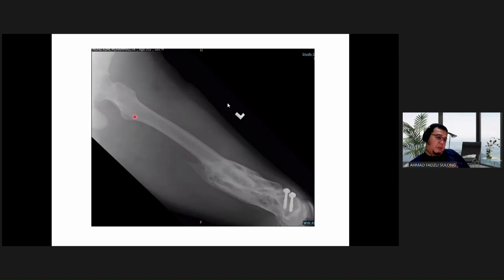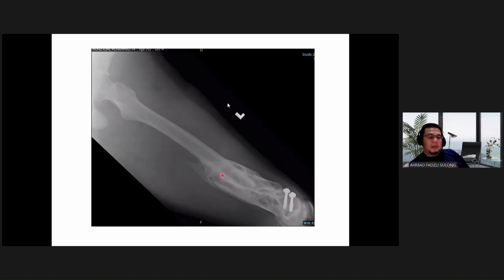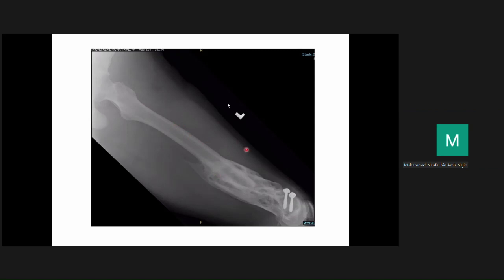But is that the proper description of angulation? Is the reference the distal part? No, the reference is not the distal part. What's the reference? The reference is the apex of you punya angulation, right? Apex angulation. So kalau macam ni, macam tu, so apex kat mana? Dekat situ. Anterior ke posterior? Posterior lah. Kalau anterior dia akan macam tu, betul tak?